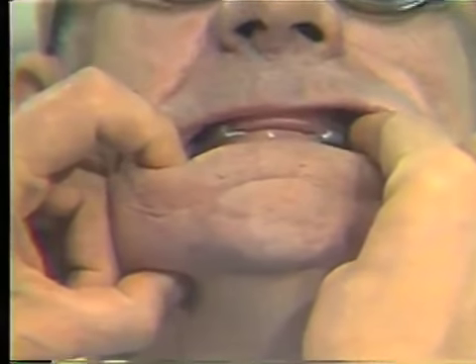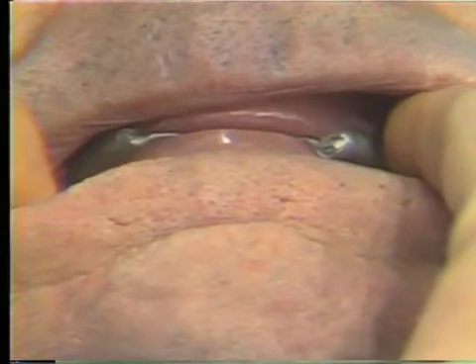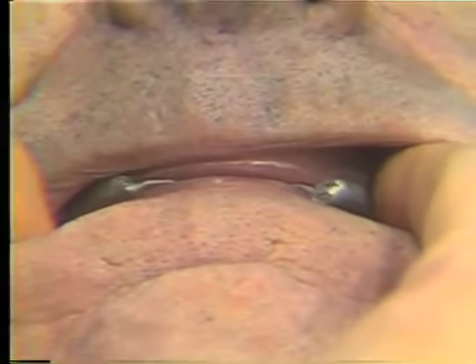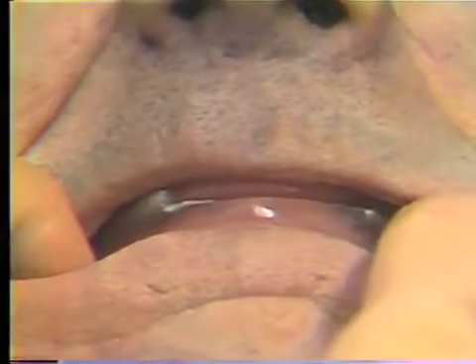You see it starting to flow. A little harder. And you're watching the anterior. And as he approaches contact, right there you will stop. Now the anterior rims are just in the slight contact that we want. That is our guide for maintaining our vertical dimension. Now, as you can see on either side, the excess soft wax is squeezed out. Now just open for me. That's right.